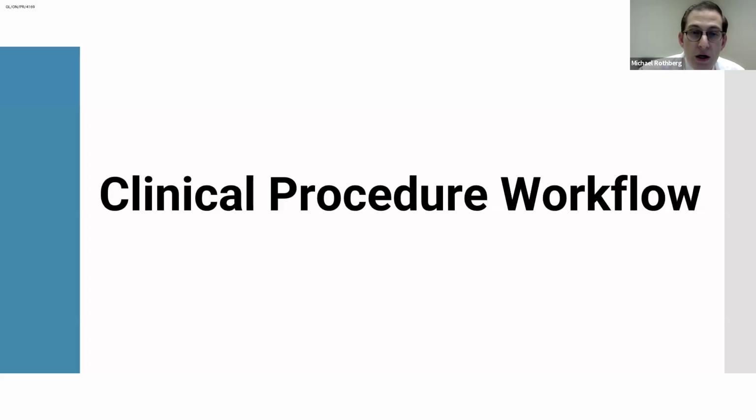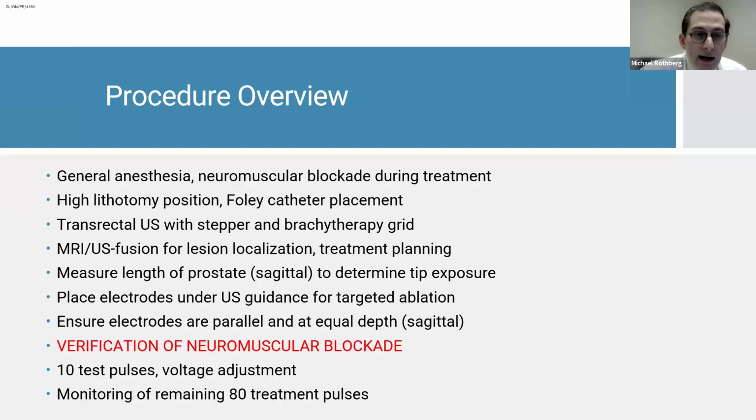So the next thing I'll do is talk about the clinical and procedural workflow that we use here to perform IRE. We'll go through each of these not only on this slide, but in subsequent slides to really bring the details home.